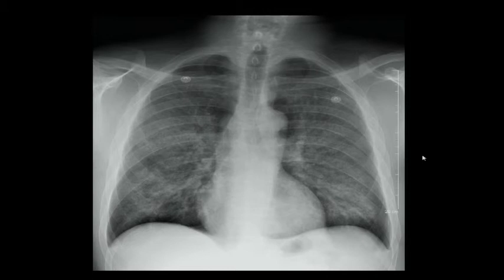So for the view of the chest x-ray, diffuse interstitial opacities. I can't pinpoint and say it's alveolar anywhere. Maybe a little bit down here, but sparing of the subpleural space. So what did you say? Diffuse airspace opacity? Is that what you said? No, interstitial, more like reticular opacities. Okay, more reticular opacities with some sparing of the lung base. Anything else?